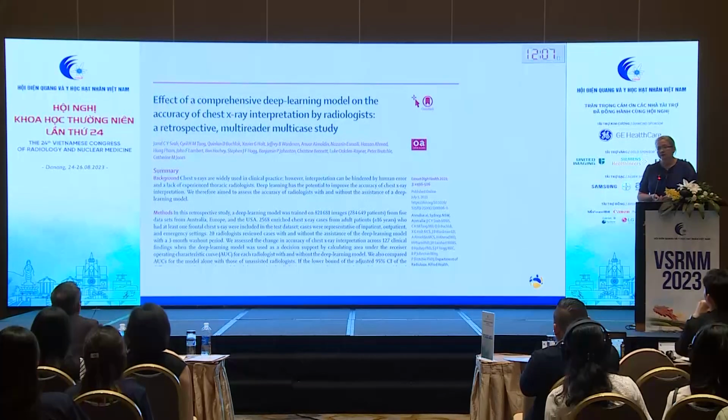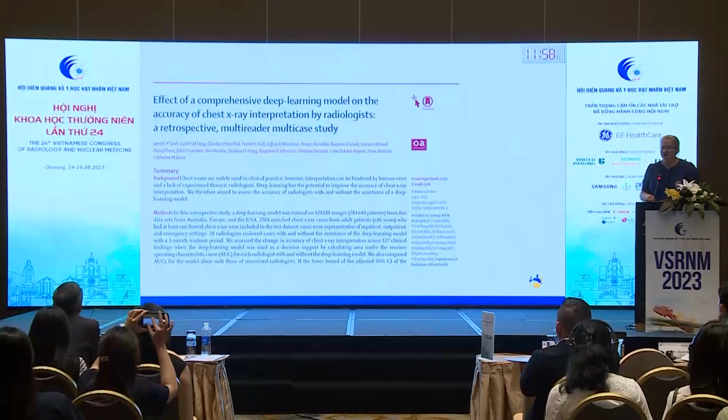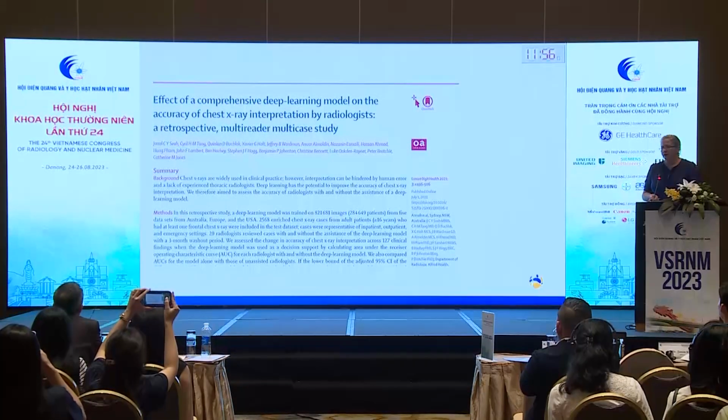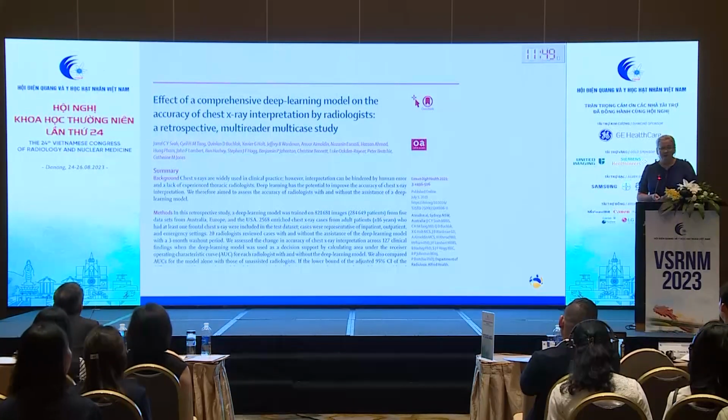So when we look at evidence, this is an example of some of the evidence that you should try to find. There are some copies, I think, in the room right now, but trying to find a case study looking at the improvement or the change of radiologist performance is really important, and it should be done in a peer-reviewed journal.